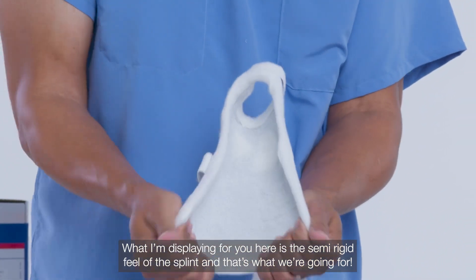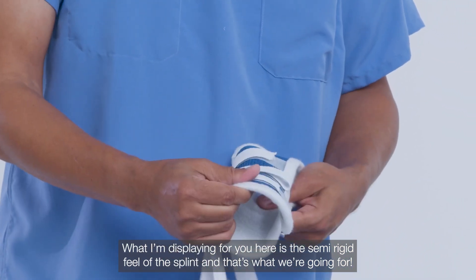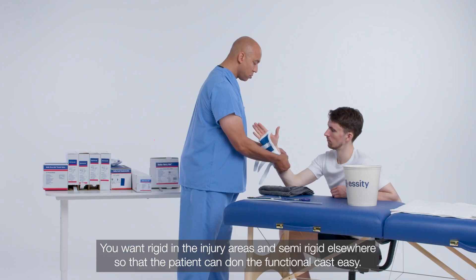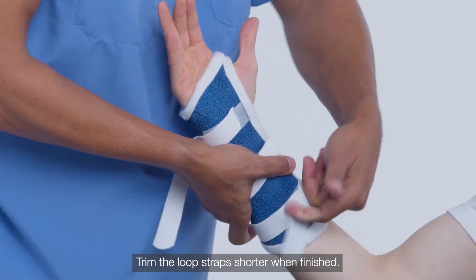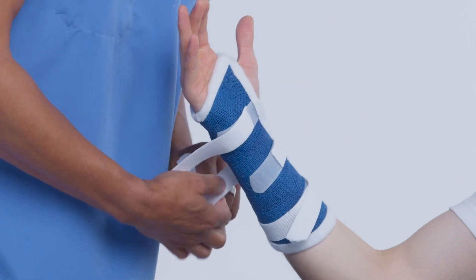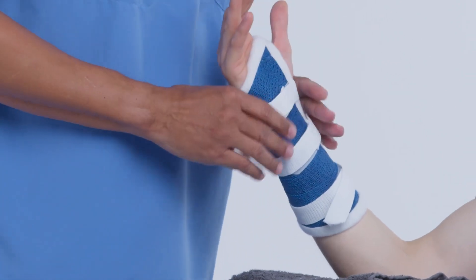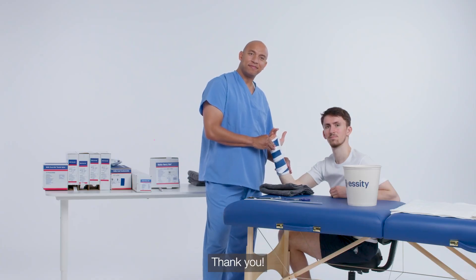What I'm displaying here is the semi-rigid feel of the splint, and that's what we're going for. You want rigid in the injury areas and semi-rigid elsewhere so that the patient can don the functional cast easily. Trim the loop straps shorter when finished. This was the short arm cast using the functional cast therapy technique. Thank you.